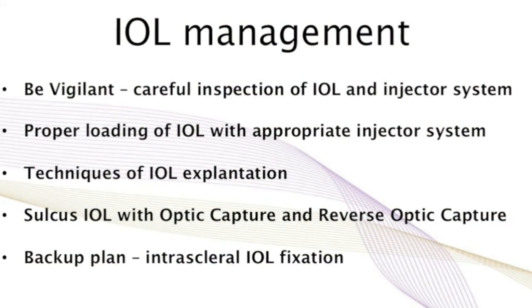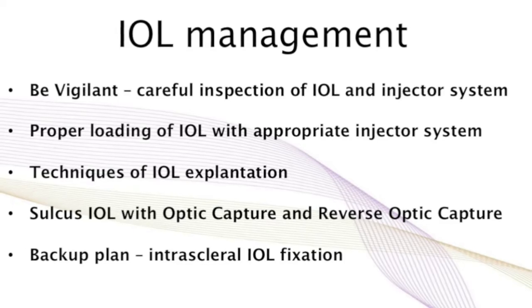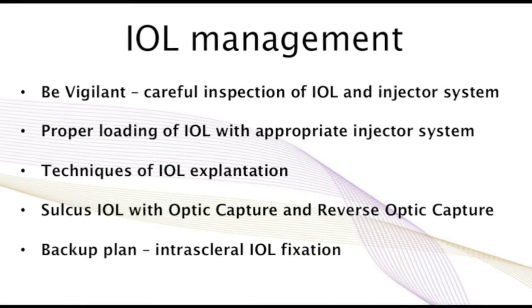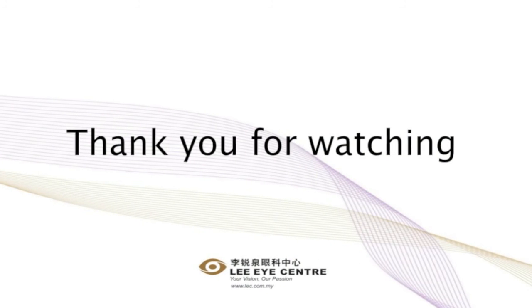Intraocular lens management is a vital component of cataract surgery. As cataract surgeons, we have to have a good set of techniques and tools in our armamentarium to successfully manage the intraocular lens, especially in tricky situations.